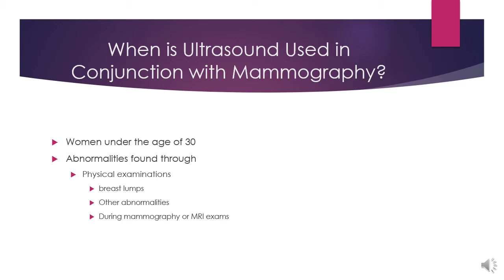Ultrasound can be used on its own or in conjunction with mammography. It is recommended for women who are under the age of 30. They will be sent for an ultrasound. And if a patient is at a doctor's office doing their yearly checkup and the doctor checks the woman's breast and feels a lump or another abnormality, or if the patient does a self breast examination and feels something that just does not feel normal to them, they might be sent on to ultrasound.